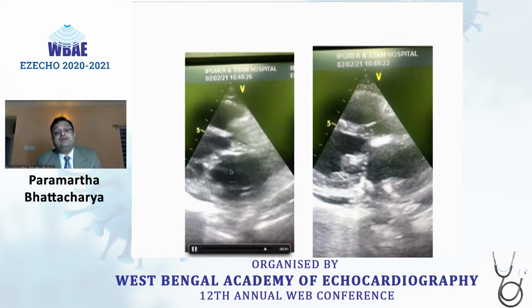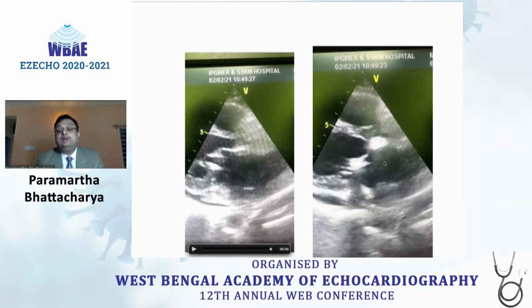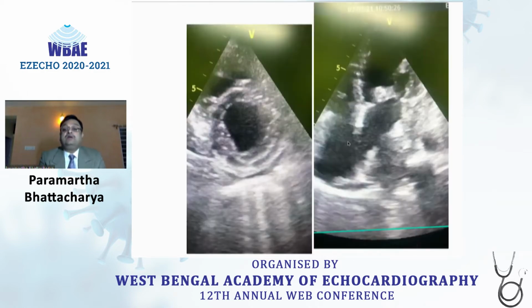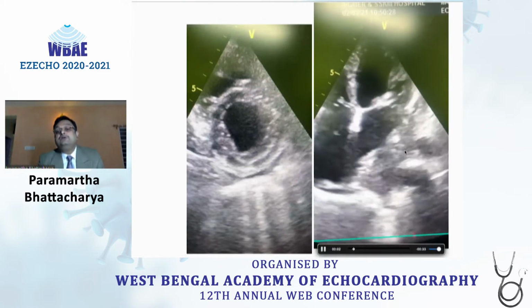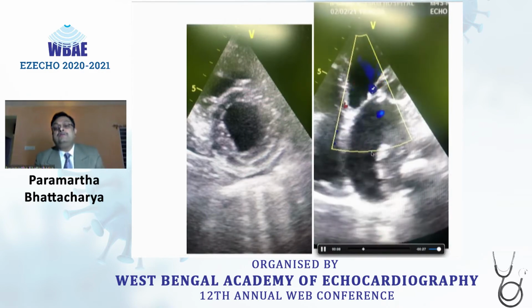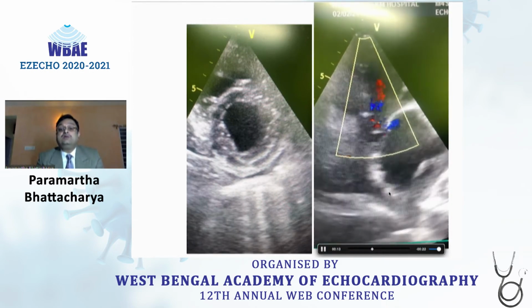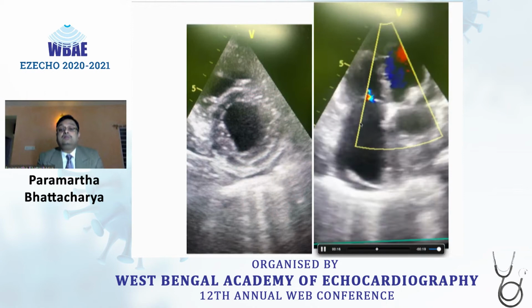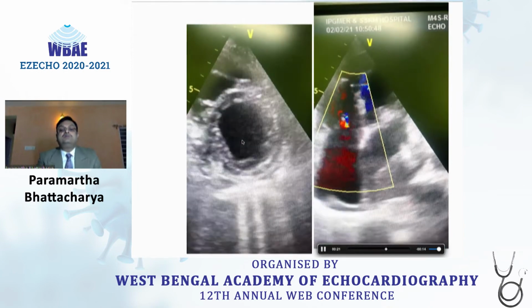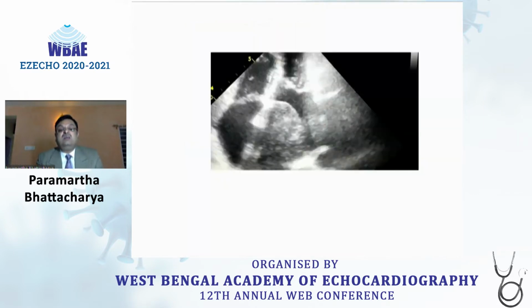The echo showed mitral stenosis of a degenerative valve, and the contraction was poor. There was a chink of pericardial effusion, and there was something in the posterior aspect of the left atrium. When we opened up the 4-chamber view, it was a huge clot, almost occupying 2/3 of the left atrium. The patient, of course, had mitral stenosis and a small mitral regurgitation, with pulmonary hypertension seen in the tricuspid regurgitation. The contraction was not that good, with a chink of fluid, probably because the patient had a high ventricular rate.